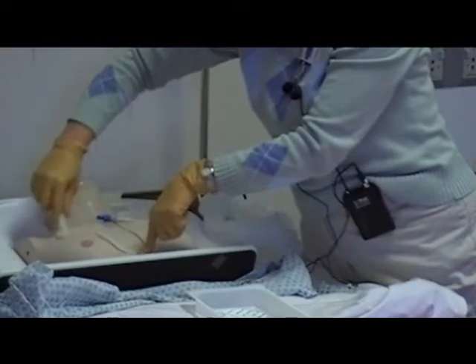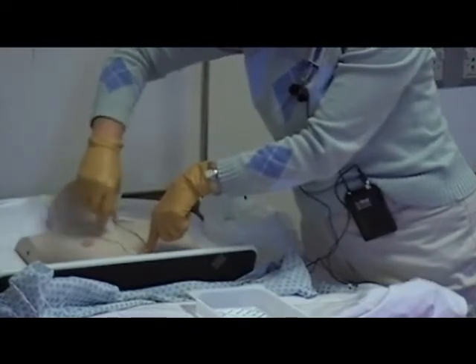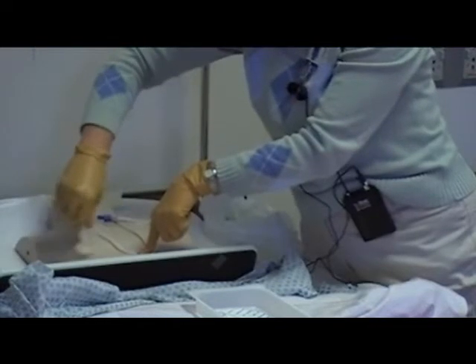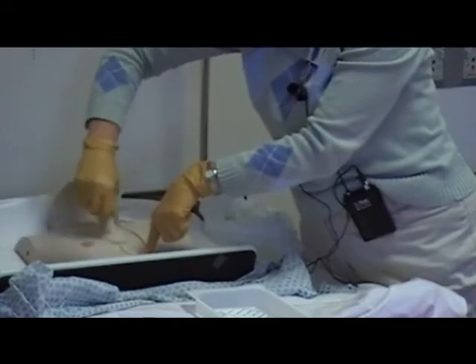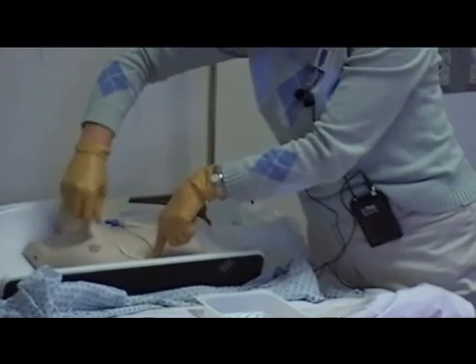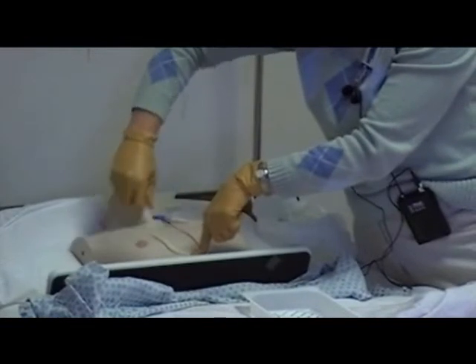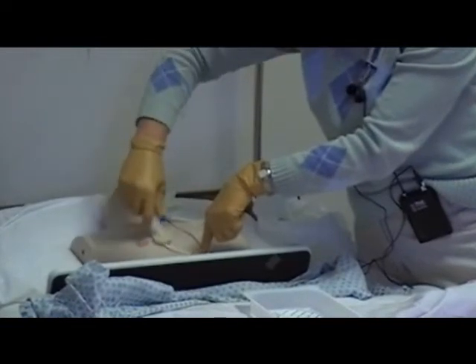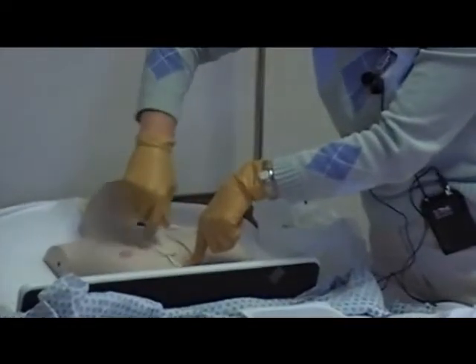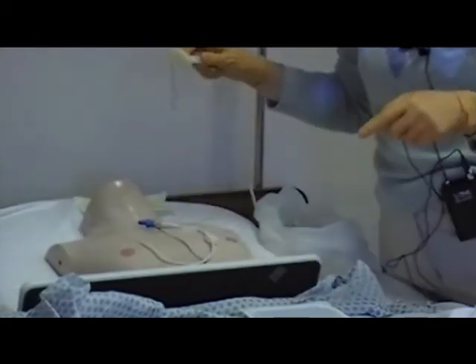Because as you scrub, you're also helping to penetrate that chlorhexidine down into the skin. You can keep your hands far enough up on the handle so that you will not touch his skin. And you are scrubbing approximately a 4-inch or 3-inch by 4-inch or 4-inch by 5-inch area, depending on the size of your dressing area. Okay? So see what your policy says.